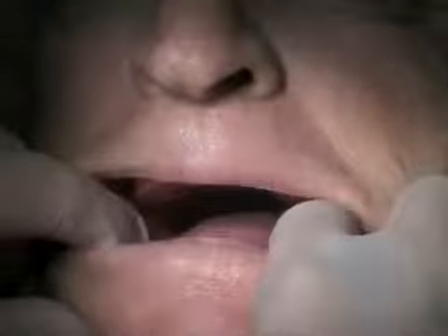Once you've adjusted both the maxillary and mandibular rims independently, place them in the patient's mouth together and check to make sure there's contact throughout the rim. Here there's a gap between the maxillary and mandibular rim in the posterior regions. Check that and adjust those as necessary. Check your occlusal vertical dimension to decide whether to add some wax onto the rim or to take away some excess contact that might be increasing the occlusal vertical dimension.